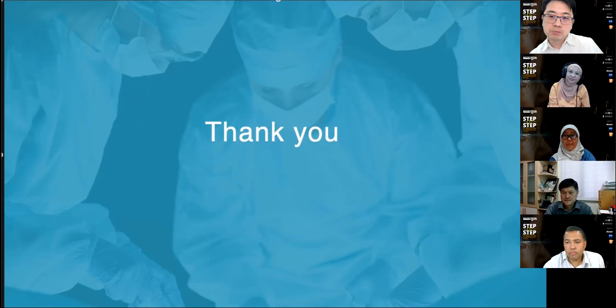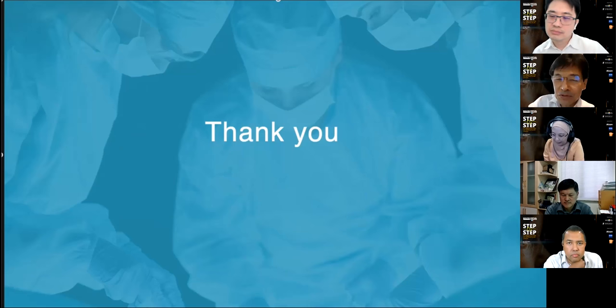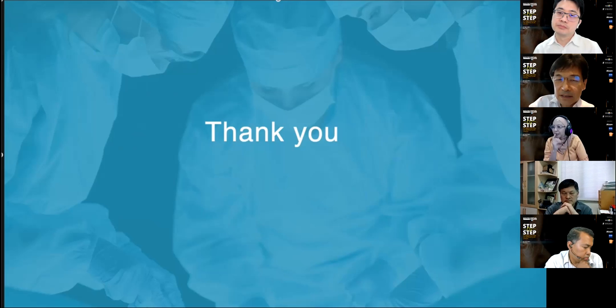Prof. Musha, can I ask you a question? Yes. The trocar assisted one is quite interesting, but the trocar size, is it 25 gauge? I was just wondering about the tunnel, it may be too big. It is a 25 gauge. If you are just maneuvering the second haptic, which you don't have to manipulate so much in the eye, most of the time it just sits in nicely. But I remember one of the articles saying that if you want to use a 25 gauge, you might need to cauterize and make a bigger flange, maybe more than 0.4, 0.5. I think that is a key thing.